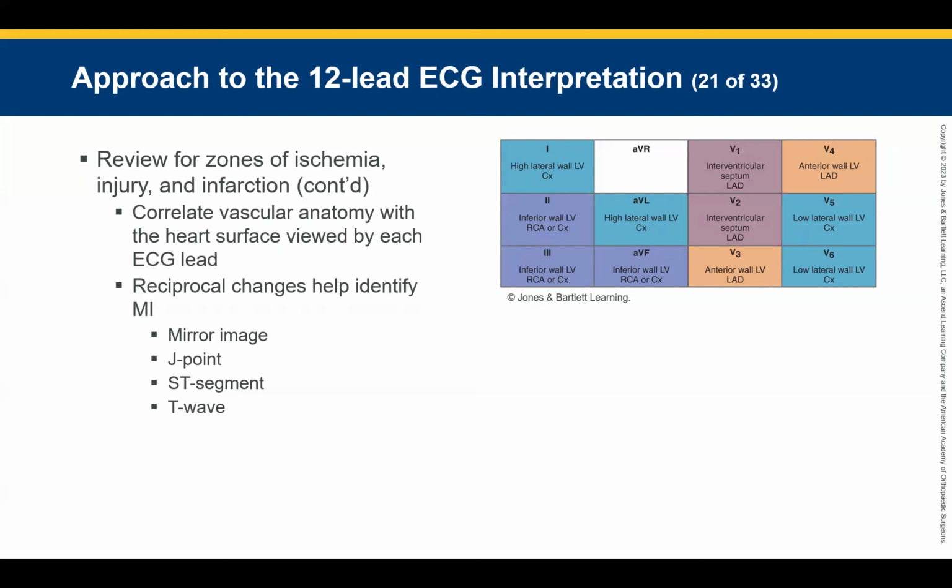It takes 7 times to remember something. Lead, lie, ass backwards, all. You guys say it for me one more time. Okay. I appreciate it. I know it sounds stupid. This is how we nail this into our head. How many boxes of elevation do we need at 1 and AVL? 1. One box of elevation, 1 and AVL. Both. Okay. 2, 3, and AVF.